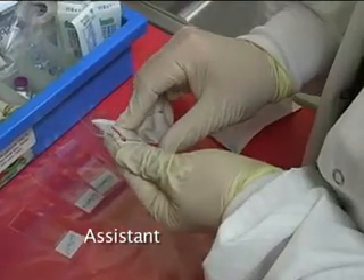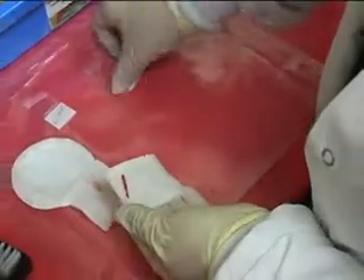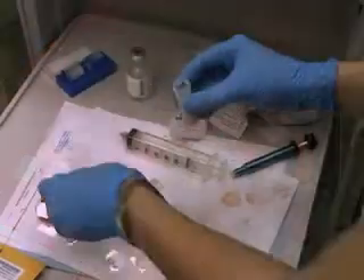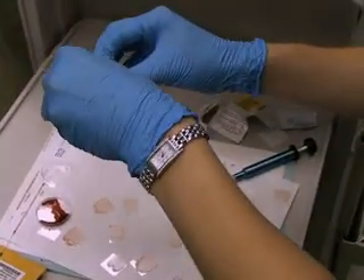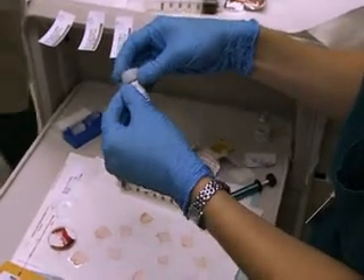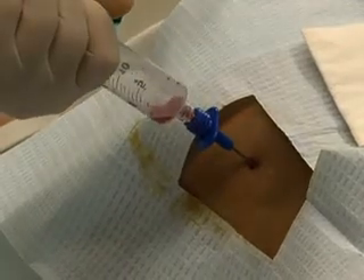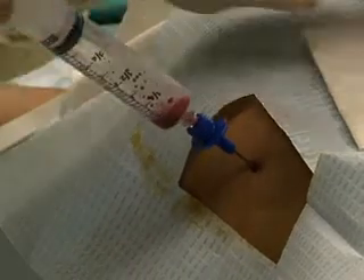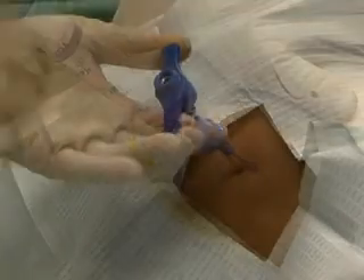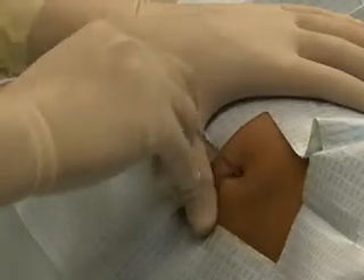If desired, a touch prep of the biopsy core can be made. The touch prep can allow for morphologic analysis similar to that obtained with an aspirate. After the touch prep, the bone marrow biopsy specimen should be placed in a proper sterile specimen container. A bone marrow aspirate and biopsy are useful tools in assessing a variety of hematologic, oncologic, and other disease processes that may involve the marrow space. Attention to detail and care for the patient can yield valuable information that is not available by routine blood studies.